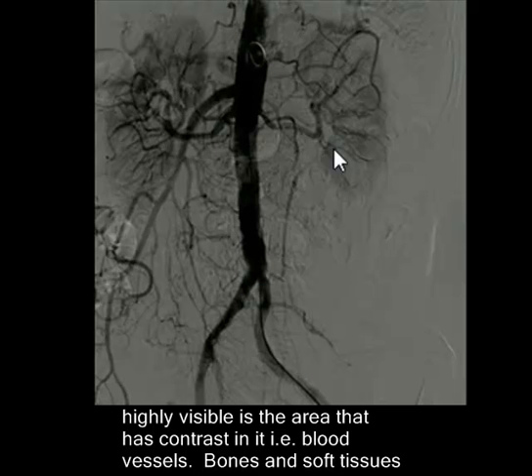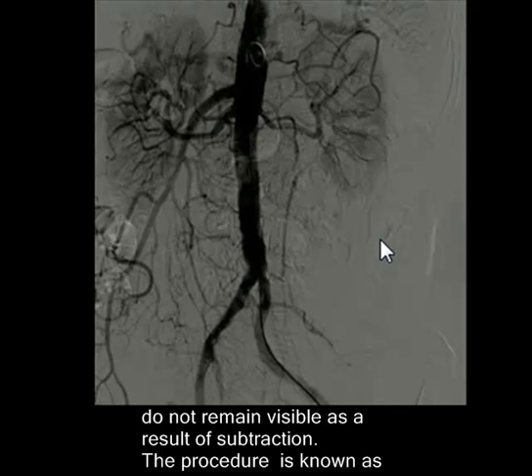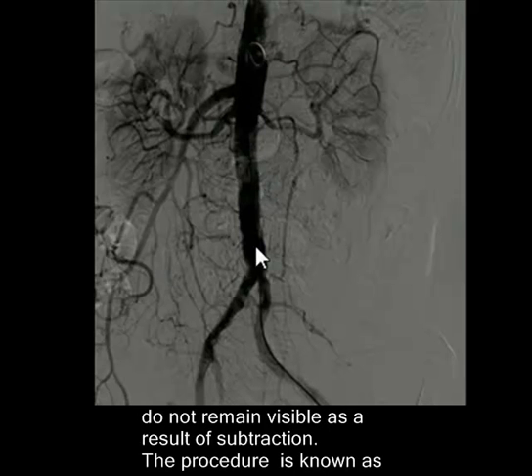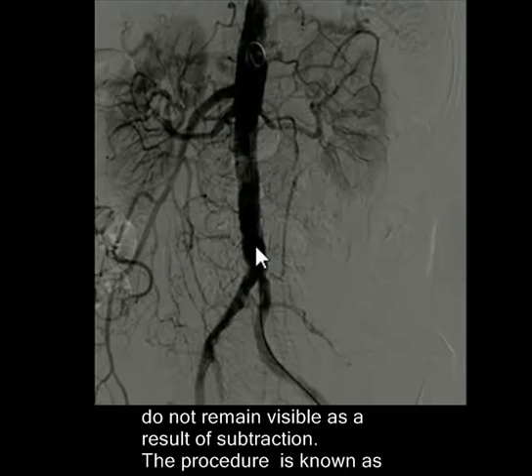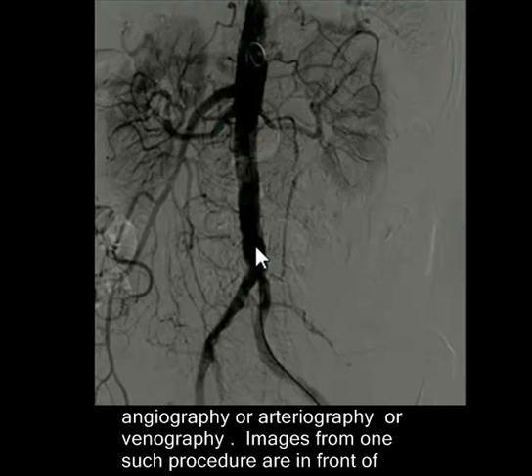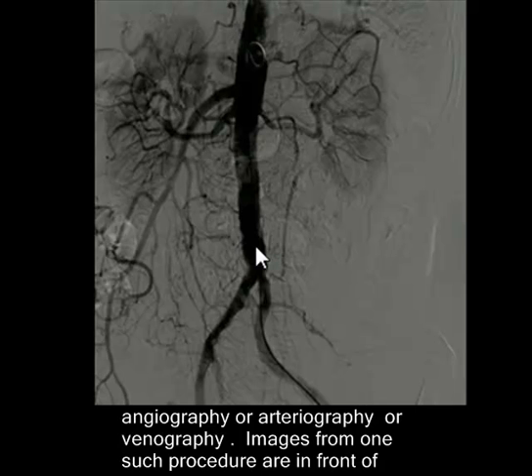Bones and soft tissues do not remain visible at all as a result of subtraction, which enhances the visibility of blood vessels. The procedure is known as angiography or arteriography, and if you are aiming to visualize the veins it is known as venography.